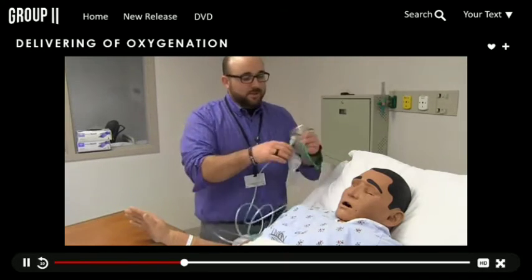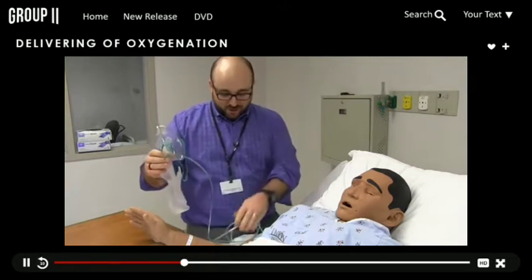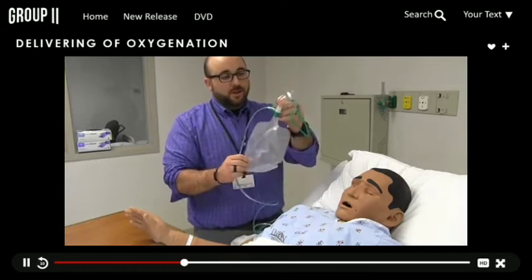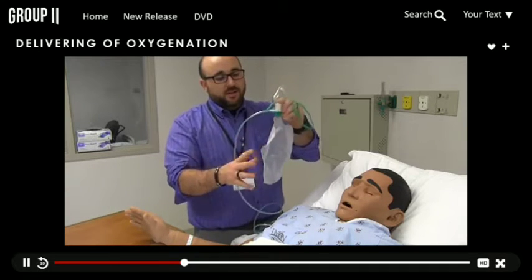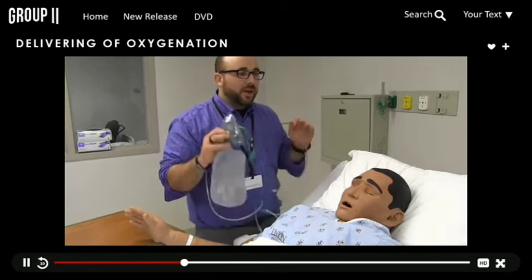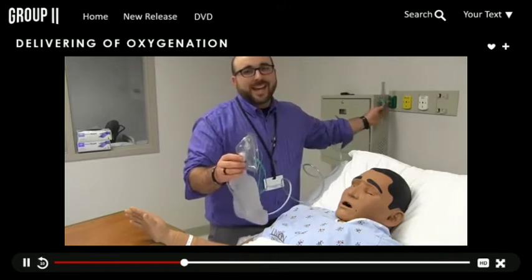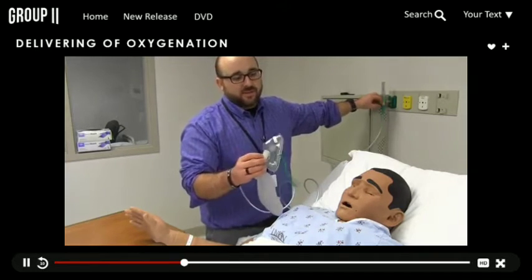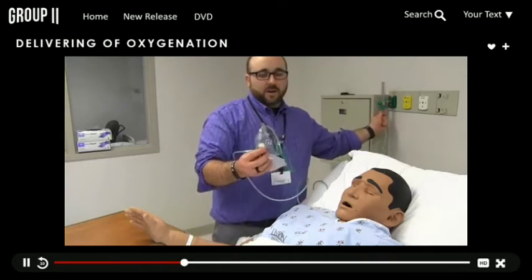The big boy that we see the most often, of course, used in the EMS world, ER, and any place where a patient's getting ready to crash, is the non-rebreather. So what this is all about is they are going to, for one, not rebreathe their CO2, but they're also going to pull 100% oxygen each breath from this. So with this device, we call it 100% that we're delivering. In all honesty, it's more like 80 to 90. It's really hard to deliver 100% unless you have an endotracheal tube in somebody or you have a CPAP mask still on their face.